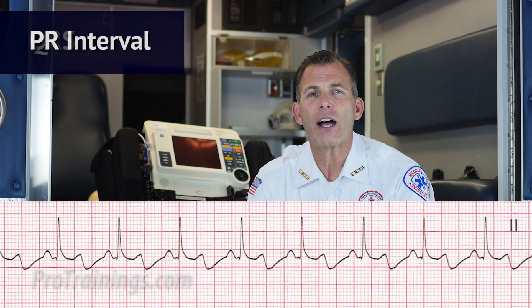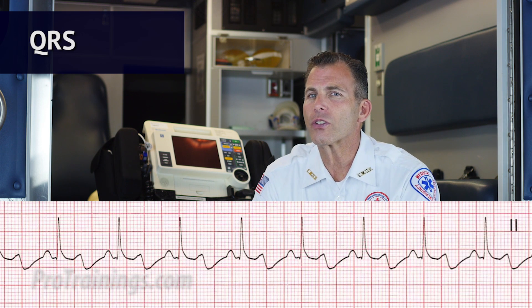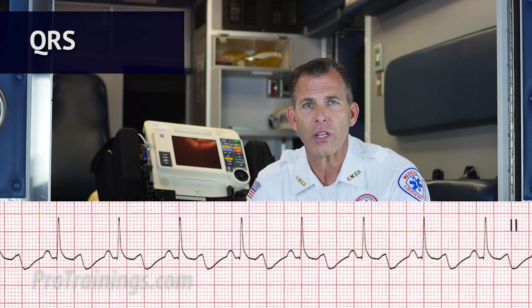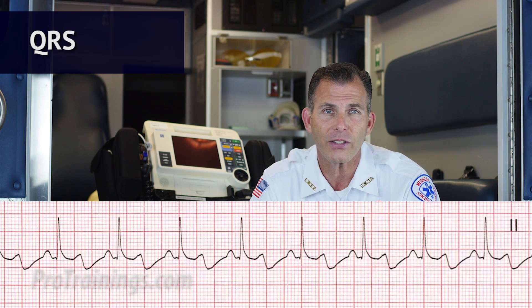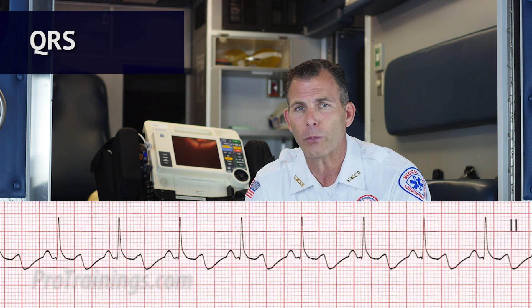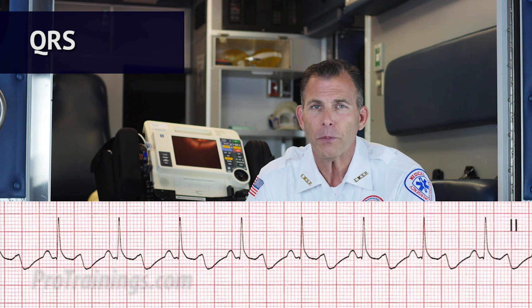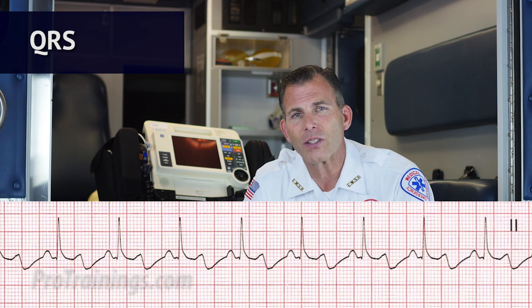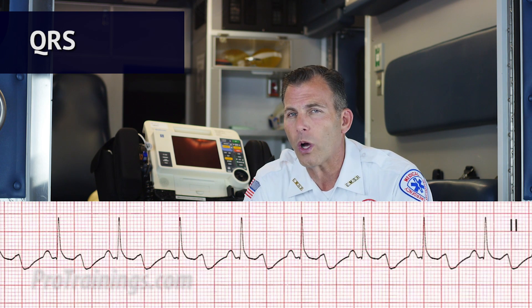So now we move on to the QRS complex of the ECG. Is the QRS interval less than 0.12 seconds? Yes it is. As long as the QRS fits within two small boxes and no larger than three small boxes, the QRS is within normal range. Is the QRS wide or narrow? In this case the QRS is narrow. Are the QRS complexes similar in appearance? We can see that each one looks similar.